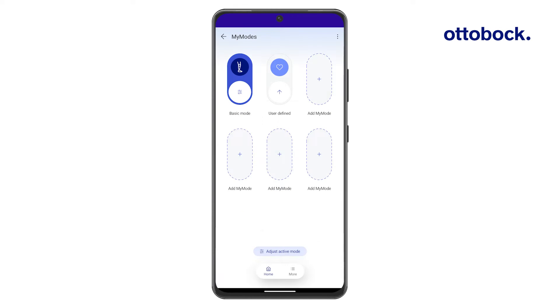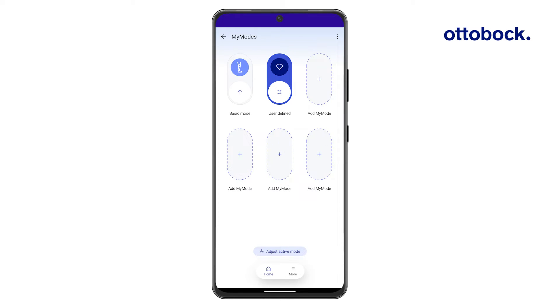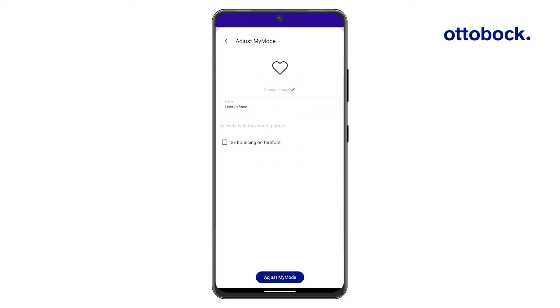To customize the MyMode, activate it with the toggle switch and press the Settings button. Now you can select an icon, rename the MyMode, and fine-tune the settings as needed.